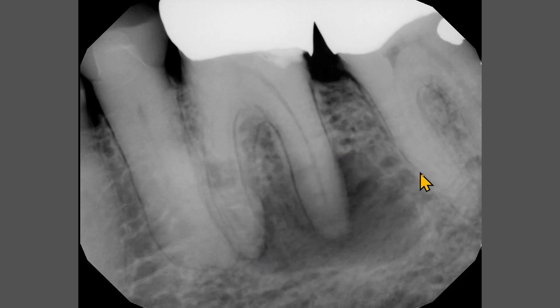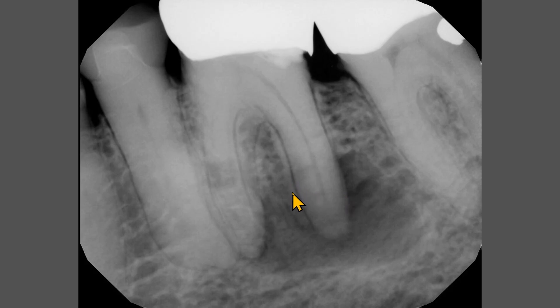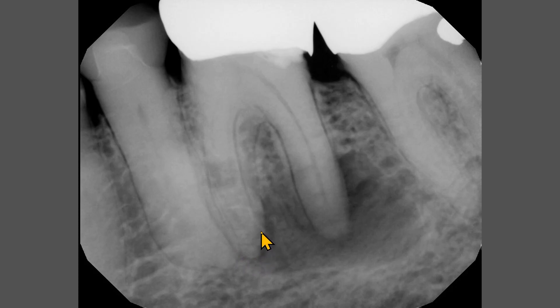This radiolucency is not circular the way we expect to see a radicular cyst. Also, the periodontal space of this tooth, at least on the mesial aspect of the distal root, is intact. Also, it seems that around the mesial root apex there is periodontal space. Also, the mesial root seems to be touching or superimposed over the premolar root.